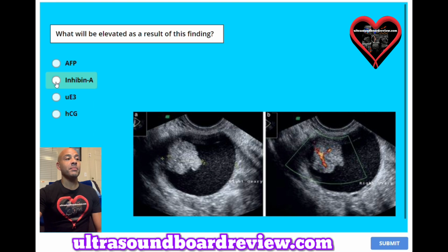The answer is B, inhibin A, and this ultrasound represents an ovarian tumor. Anytime you have tumors growing, you will have elevated inhibin A and or inhibin B.